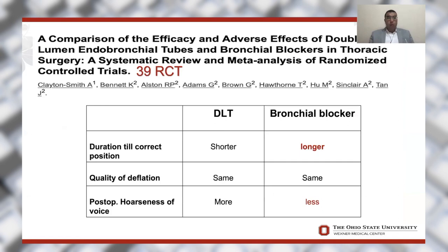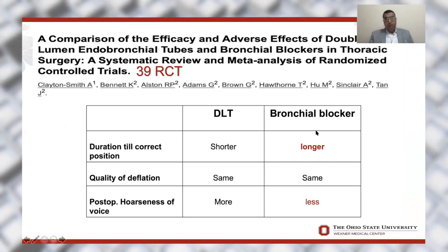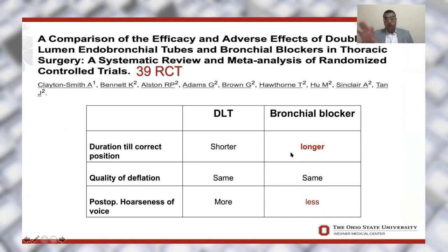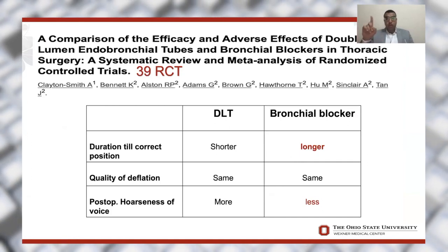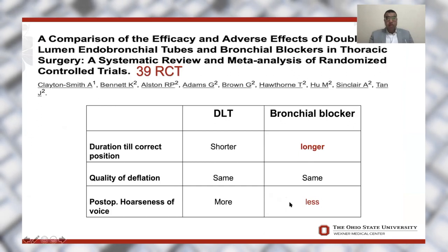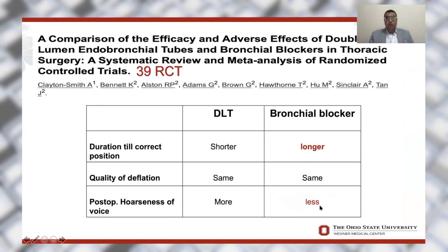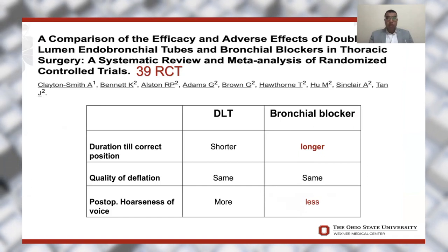Which is better, double lumen or bronchial blocker? Bronchial blocker may take a longer duration. For sure, there is no longer duration with the EZ blocker, but this randomized controlled study says that the bronchial blocker has less postoperative hoarseness of voice, and this is a good issue to consider for sure.